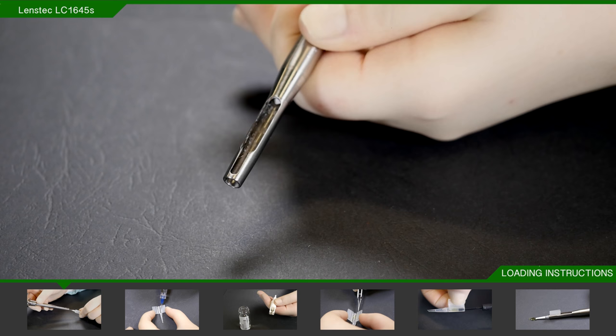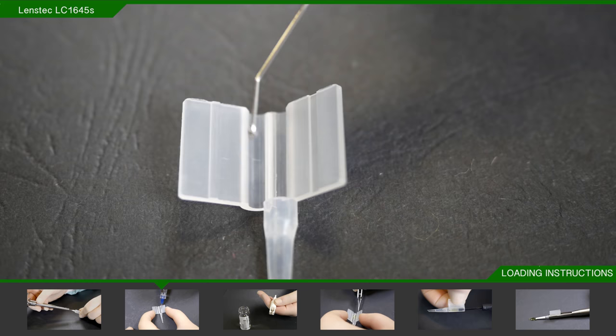When this is in place, pull or screw the injector as far back as it will go. This can be done at the beginning of the operation.